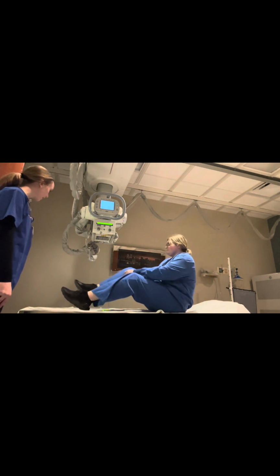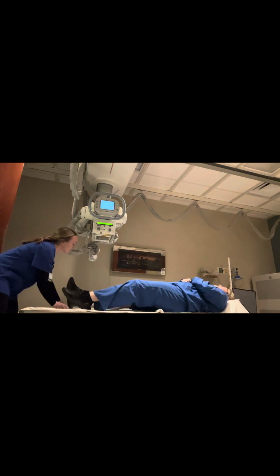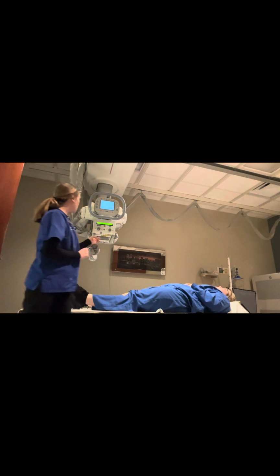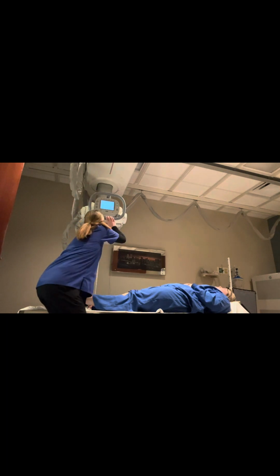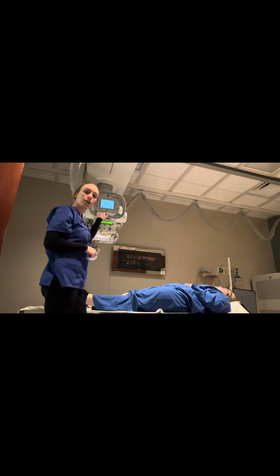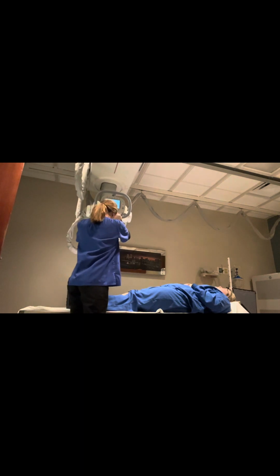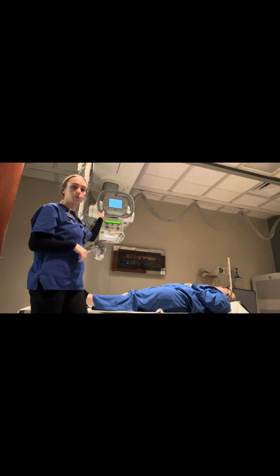I'll have you extend that left leg across our image receptor and go ahead and lift that pant leg up. And I'm going to palpate her condyles to ensure that there's no rotation in the lower leg. I'm also going to ensure that this is done at a 40-inch SID. And then we are going to center at the mid-lower leg region, while also ensuring that our collimation is open to include both the knee and the ankle joint.